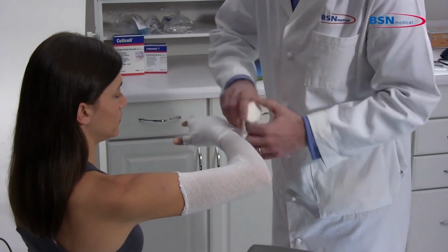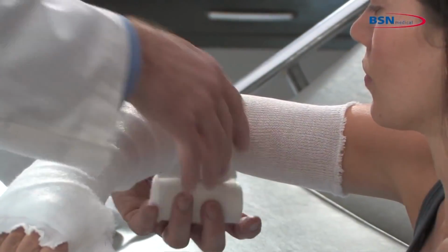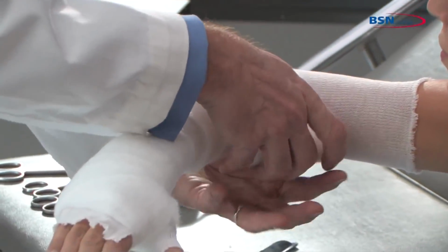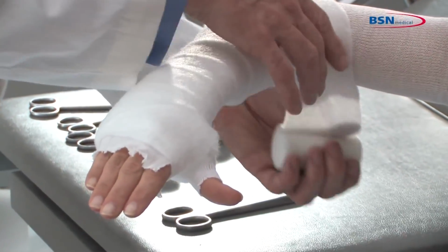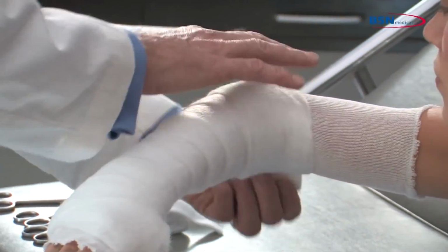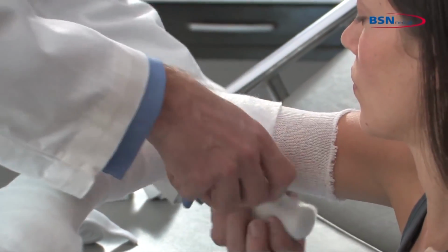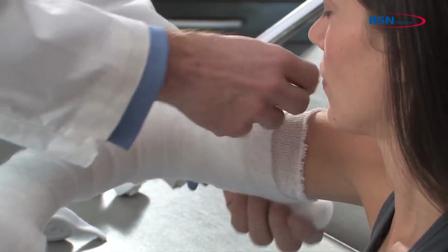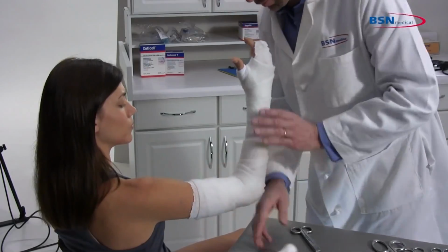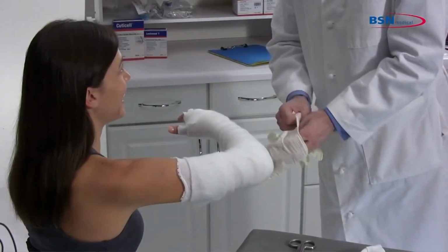Continue proximally around the elbow to the upper arm. Avoid placing the edge of the padding in the antecubital fossa. Applying with a slight tension will allow the padding to lie down smoothly and have a snug fit. Additional padding may be required for bony prominences. Make sure patient limb position is correct before starting to apply the cast tape.